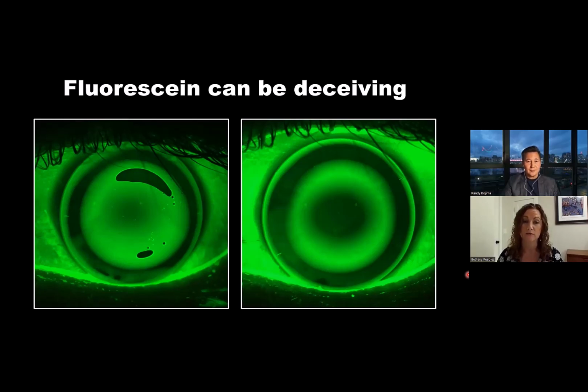If it has a general ortho-K pattern, the patient's relatively comfortable, you're going to send the patient home with the lens, because that follow-up topography, what we see, what's actually happening in the closed eye state overnight, that is certainly the key. And that's going to show us what we need to do. And that's not to say fluorescein pattern isn't usable. We do want you to take a look at the fluorescein pattern, because it's nice to use for troubleshooting purposes, but we use it in conjunction with the topography outcome.